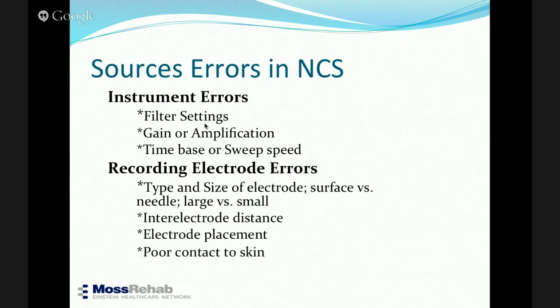Missing something by using the surface as opposed to the needle? Mm-hmm. Well, yeah, there's more distance between where you're recording from if the surface is X amount of millimeters from where. So can you rely on the amplitude when you do needle? By the way you're asking that, I'm saying no. Oh, wow.